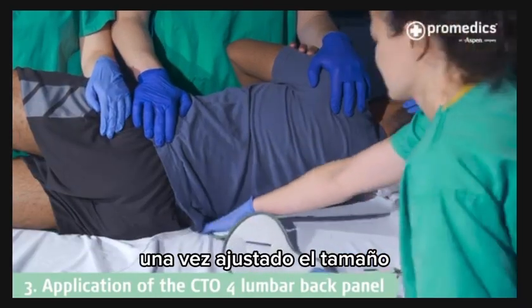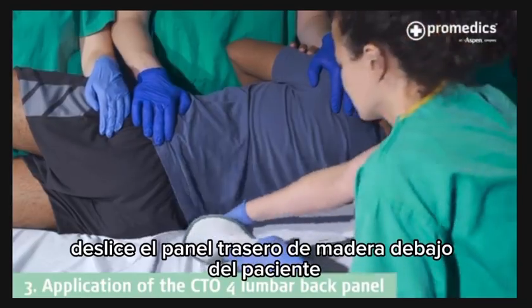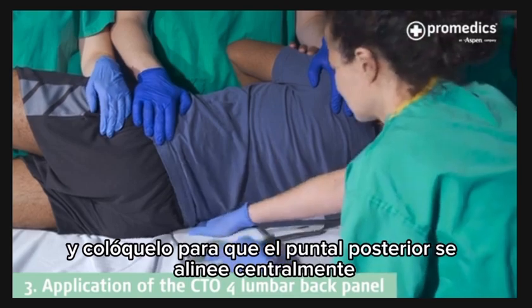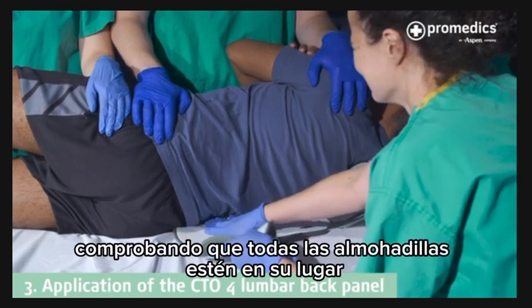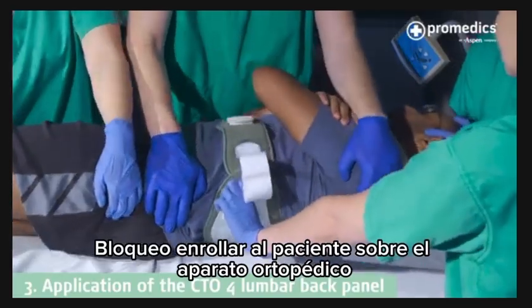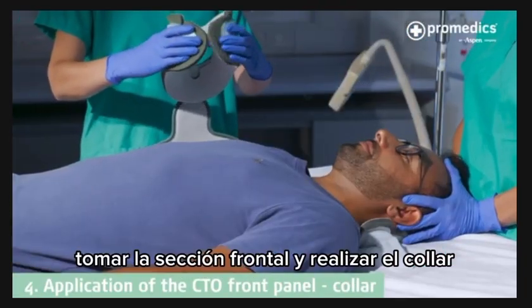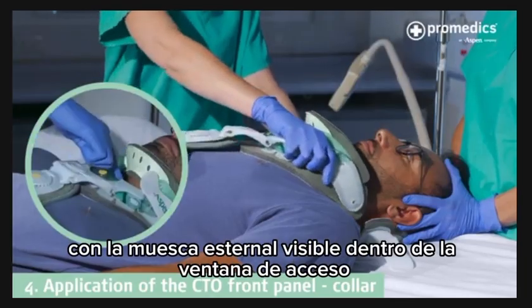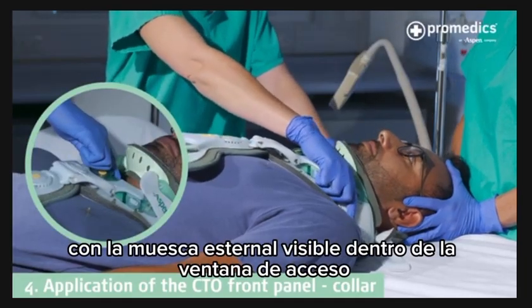Once the sizing has been adjusted, slide the lumbar back panel under the patient and position so that the posterior strut aligns centrally, checking all pads are in place. Log roll the patient back onto the brace. Take the front section and pre-form the collar. Slide this under the patient's chin with the sternal notch visible within the access window.